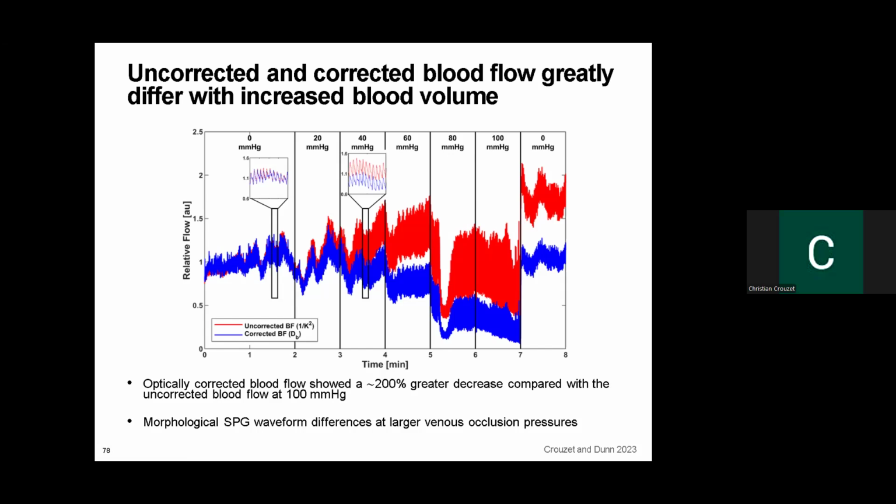Oh, like Valsalva. Yeah. We've done a little bit of that work as well with Michelle Kine's group. But for this one, ideally, the person would just have normal breathing the entire time. This is a relatively long acquisition. It's 8 minutes long. So it's kind of natural for that to happen, so no fault to the subject.